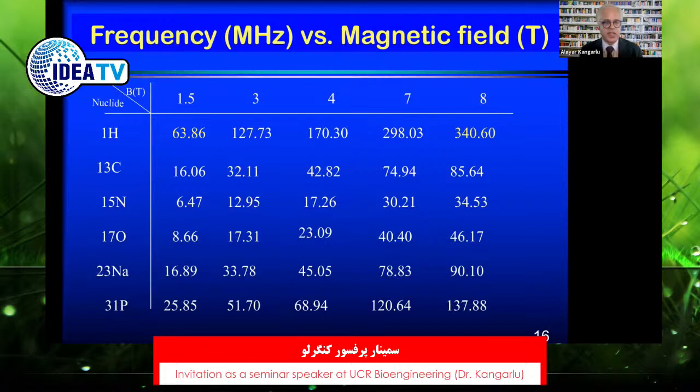So in this table, you're looking at the gyromagnetic ratio of various elements. Specifically, remember that in 1985, the dominant magnets in the clinical setting were 1.5 Tesla, and that makes the operational frequency of those scanners 63 to 64 megahertz.